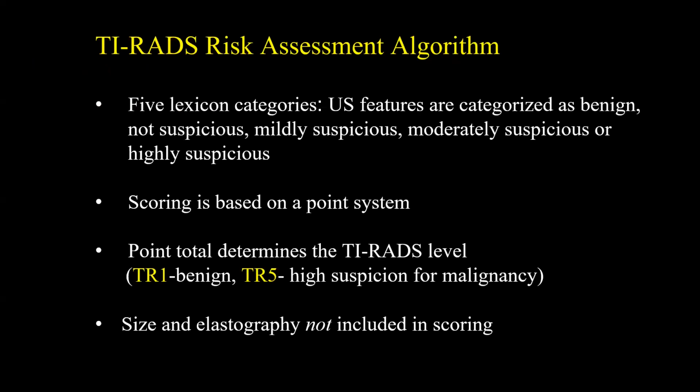We're not using size or elastography. Mostly elastography, although there are some benefits to it. Many places don't have it as a component. And since we want this TI-RADS system to be taken up by everybody, elastography was not included. Size was not included because just because you have a big nodule does not mean there's an increased risk of malignancy, and you can have a sub-centimeter nodule that's malignant. It does help guide us, but it's not a definitive component to the TI-RADS.